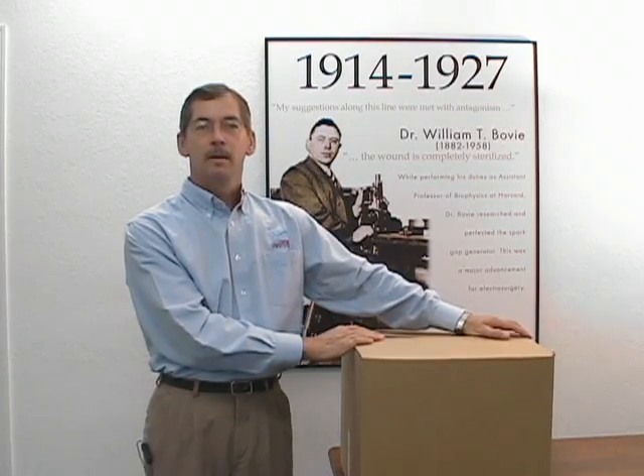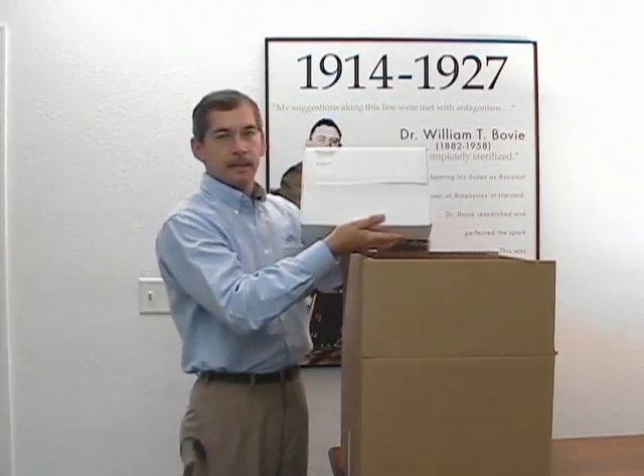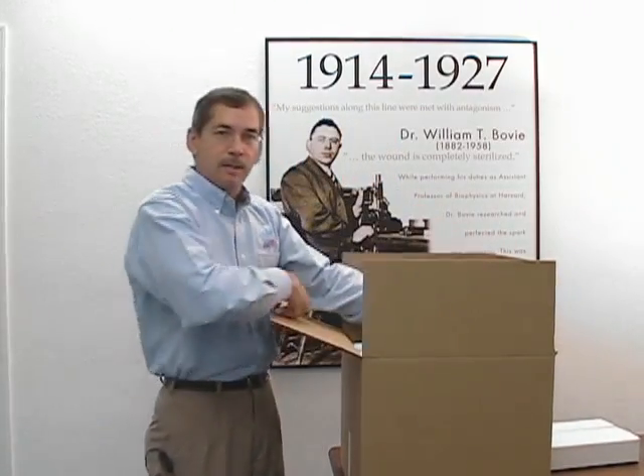What you'll find when you open the box is an accessory kit. Next you'll find your ARIN 1250 package and protective foam.